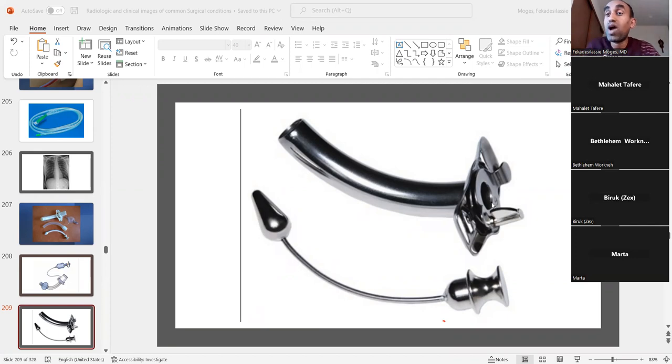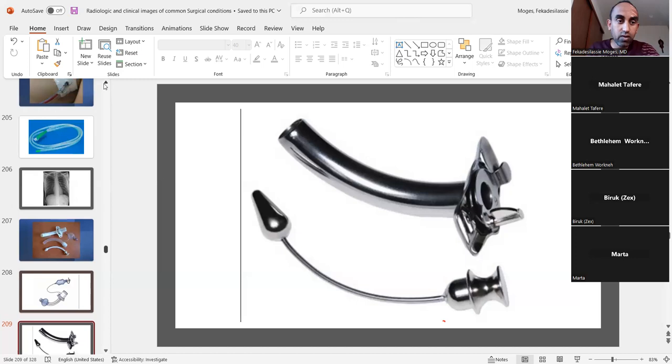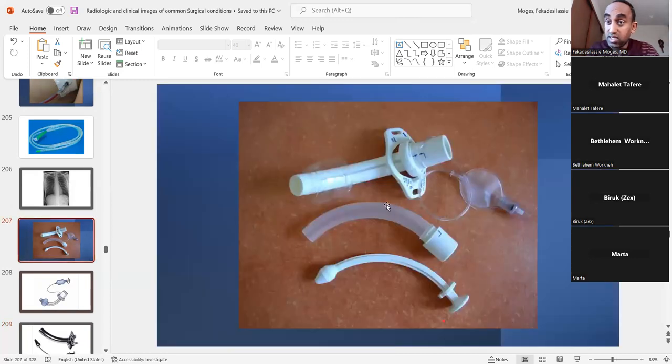What about the inner tube? Why do we need the inner tube is the question. So we used to have a very big challenge in the past because we had limited access to metallic tracheostomy tubes with inner tubes. And the type of tracheostomy tubes we had was plastic ones, and the plastic ones never had an inner tube. Very bad. So always it was a drama. Why do you think that was a drama if you don't have the inner tube? Having the inner tube is a big security. So why is that?